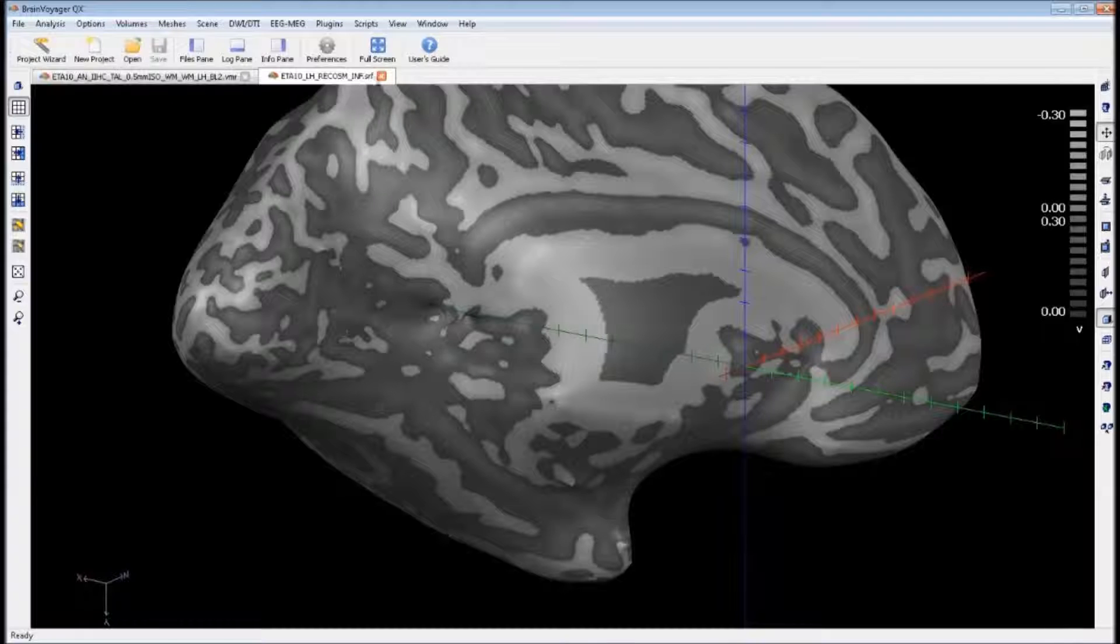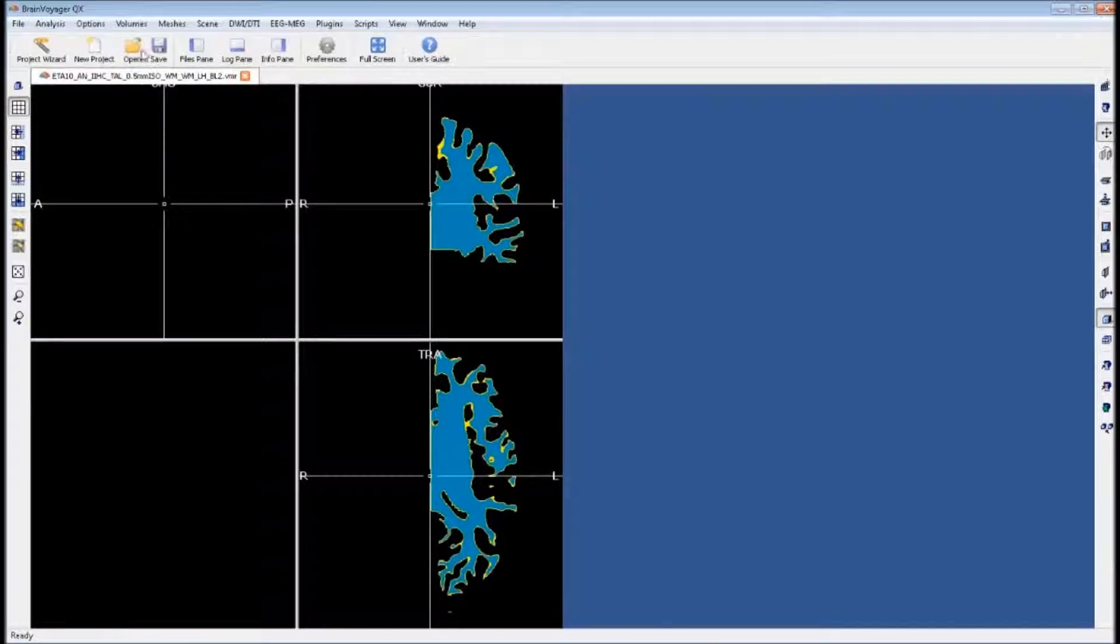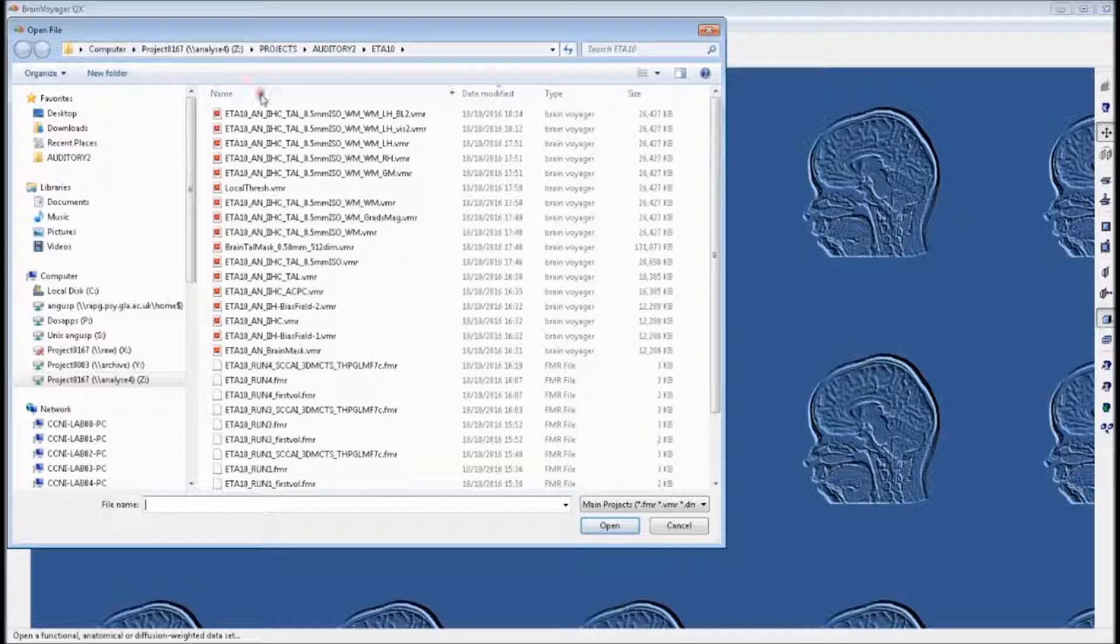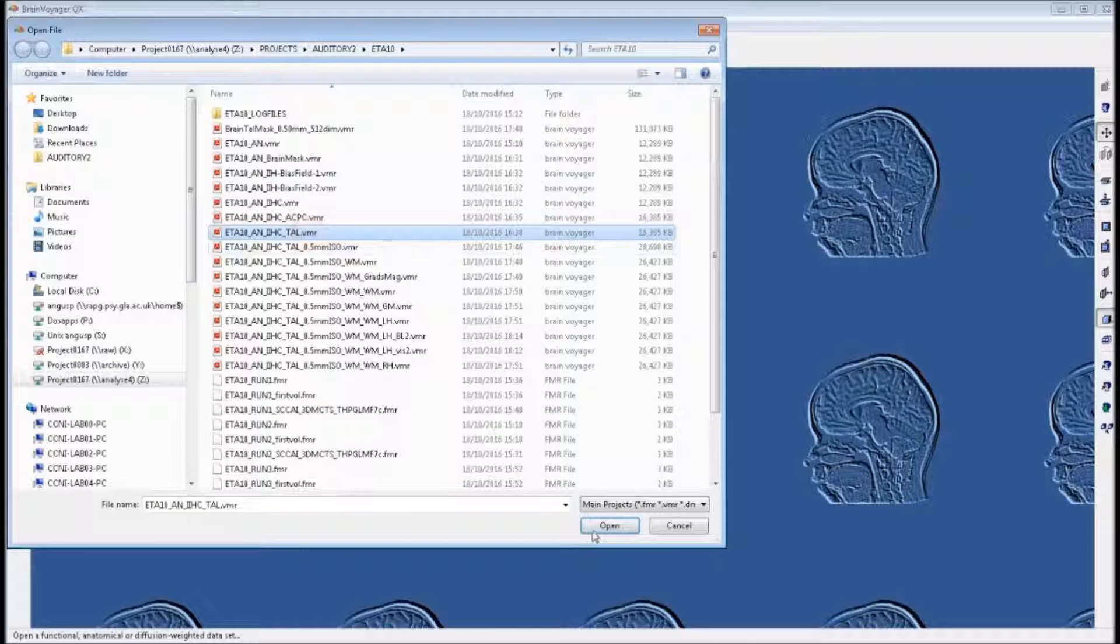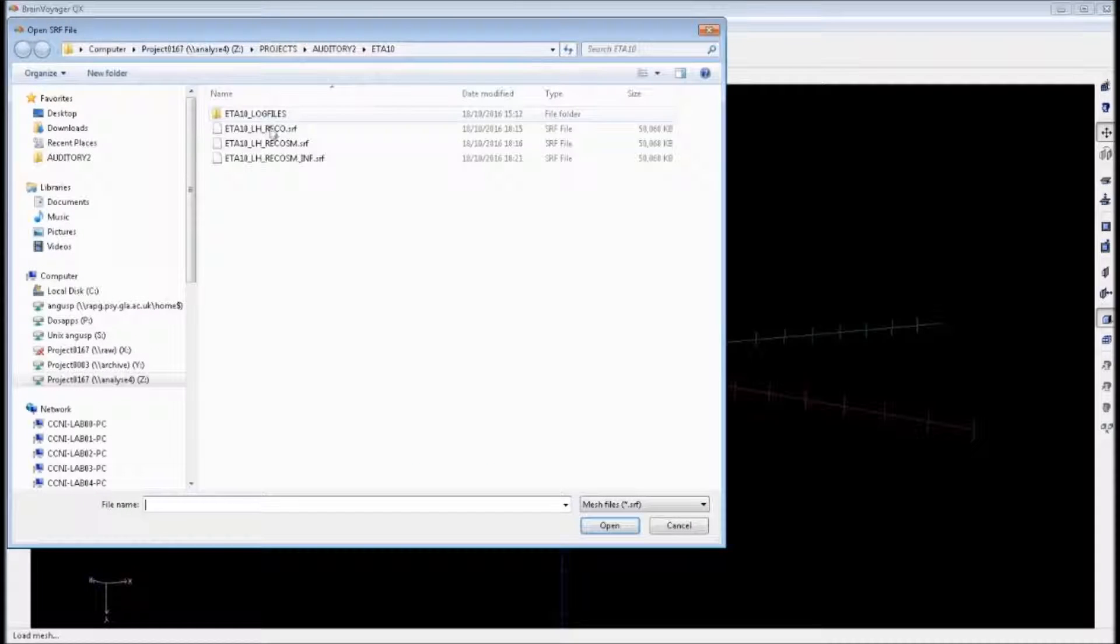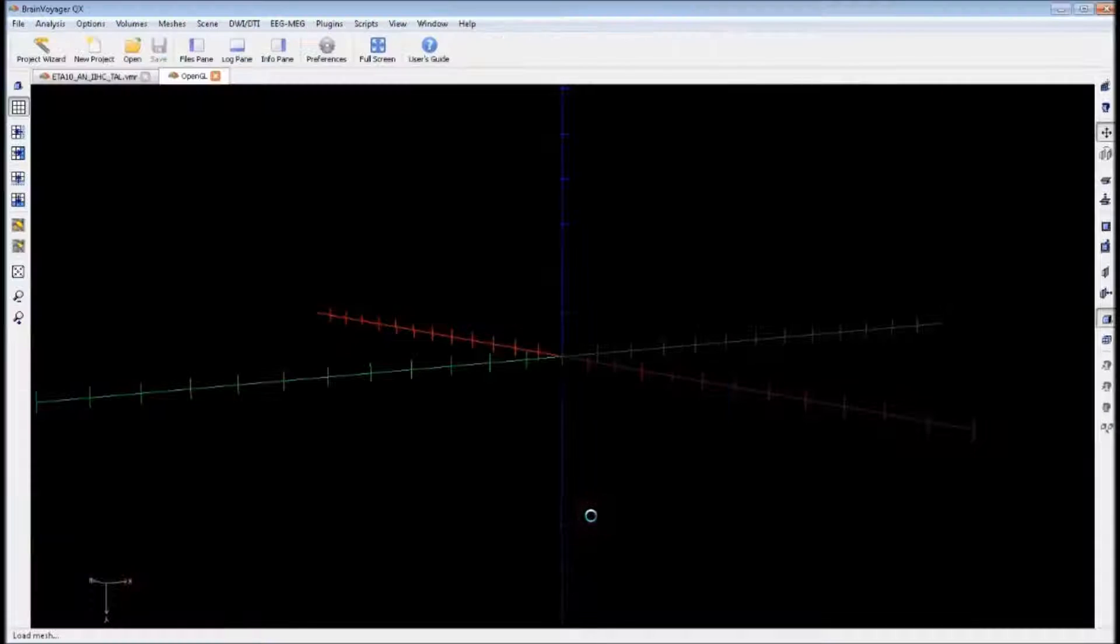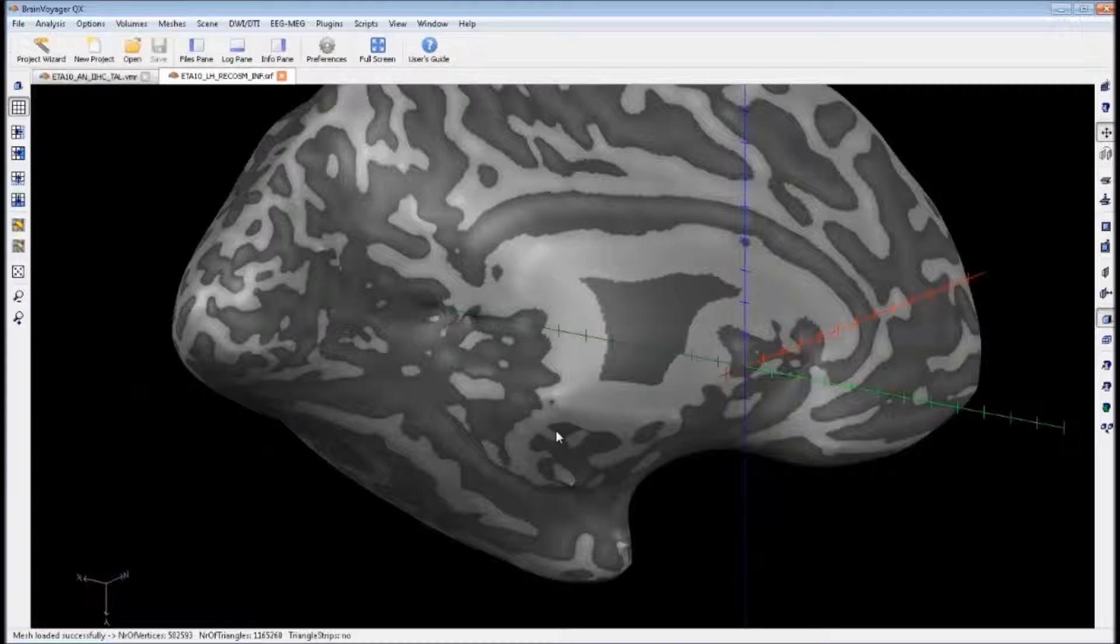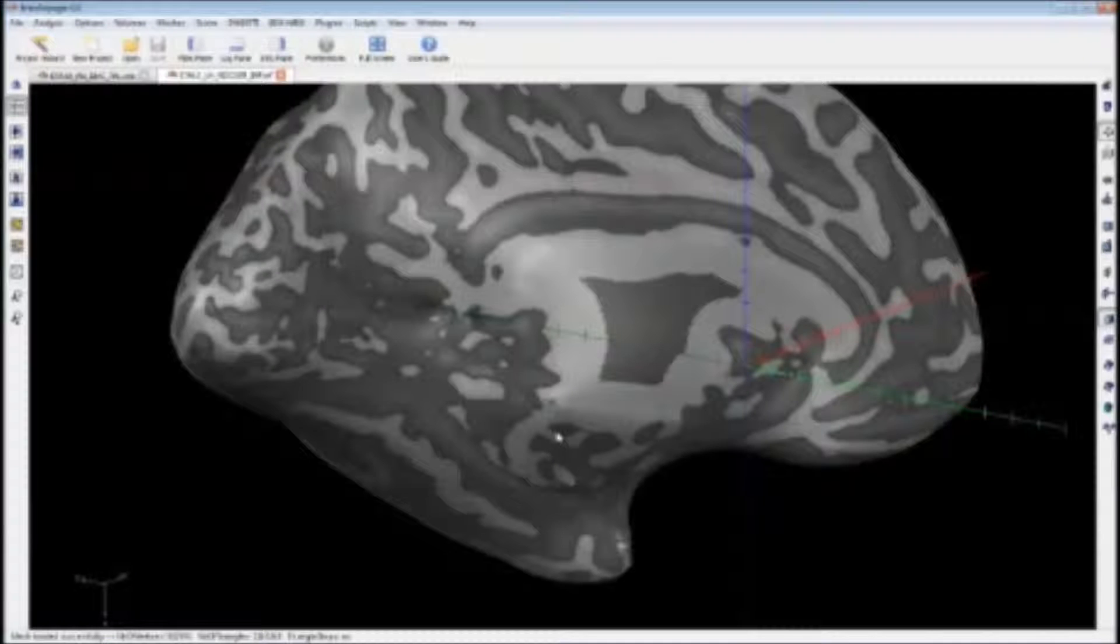What we can do now is we can close these tabs, open up our Telerac VMR and we can open up our new mesh. If we were doing some analysis using our Telerac VMR and some Telerac VTCs, we could then put those statistical maps onto our newly created mesh. And you can repeat these steps for the right hemisphere, so you have both an inflated mesh for the left and right.